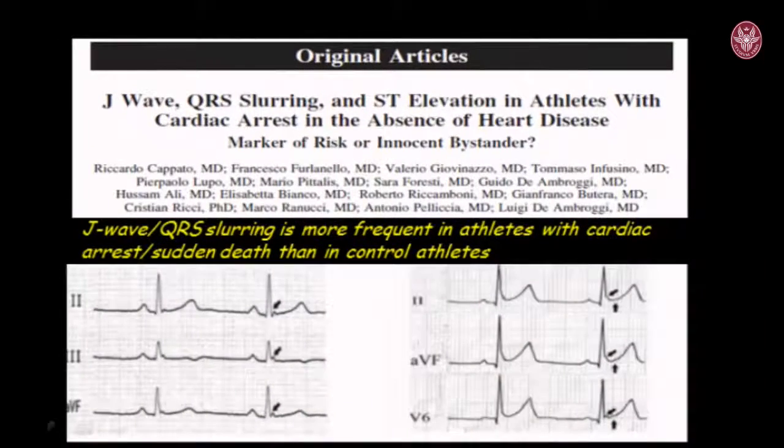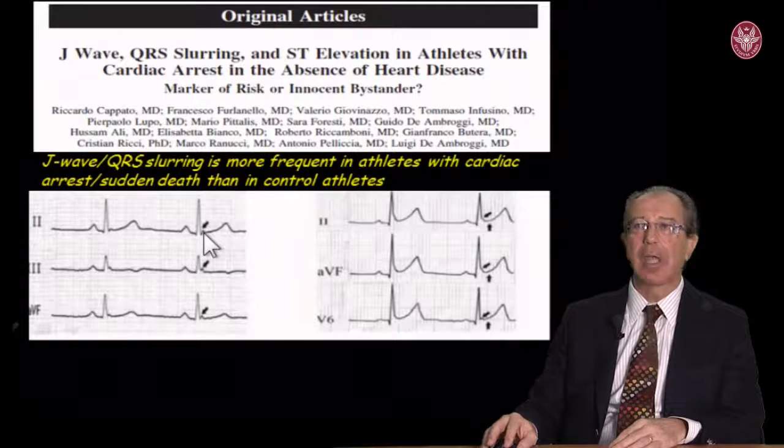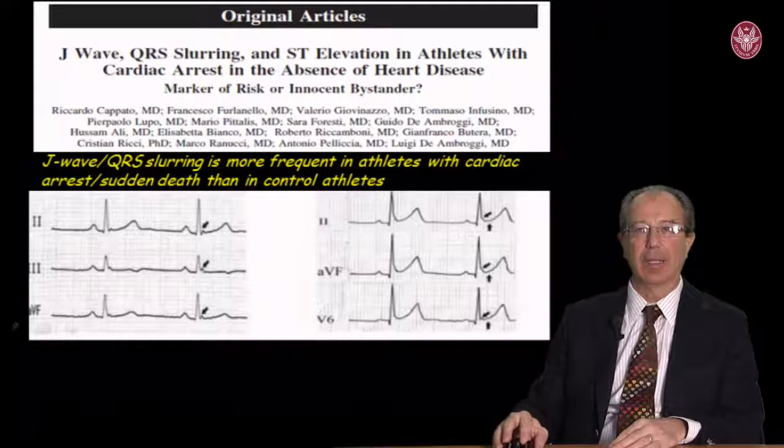There were also other reports in athletes. I just want to mention the Riccardo Cappato paper in Circulation a few years ago, where Riccardo described the presence of a prominent J wave in athletes who had incurred a cardiac arrest or sudden cardiac death, in a proportion larger than in normal athletes.